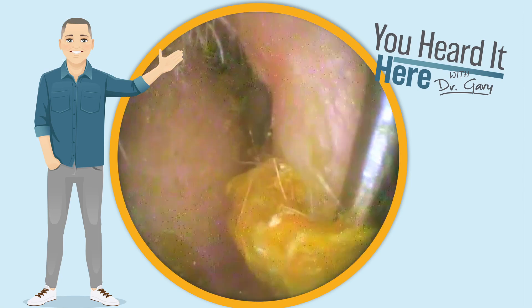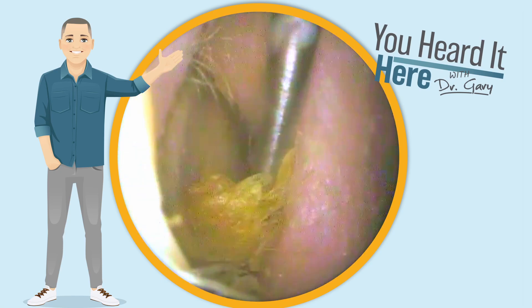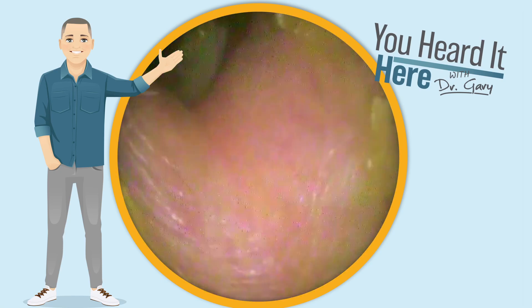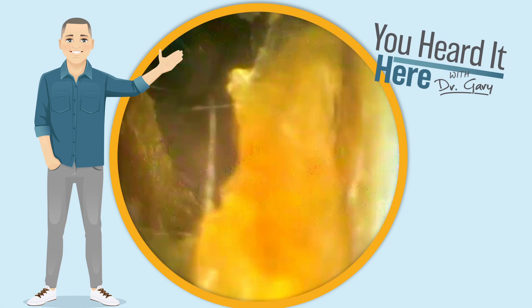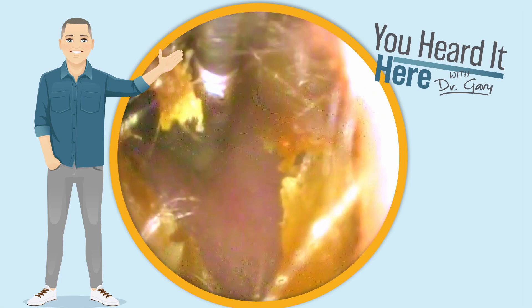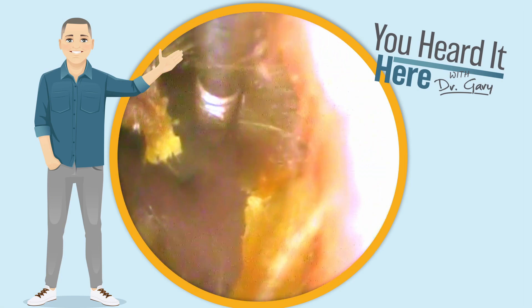We're going to take a look at a patient that we've seen in these videos before. This patient suffers from adult chronic ear infections and utilizes PE tubes. You can see a little glimpse of it right there — that little blue back by the eardrum. We've worked with this patient for many years.